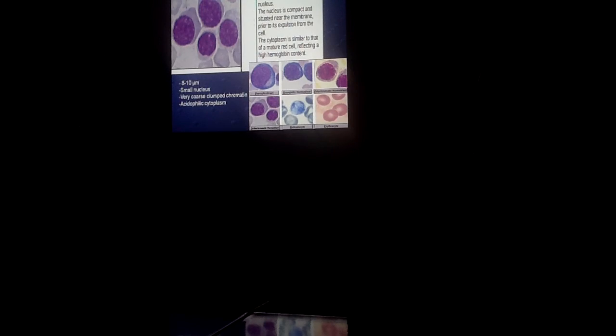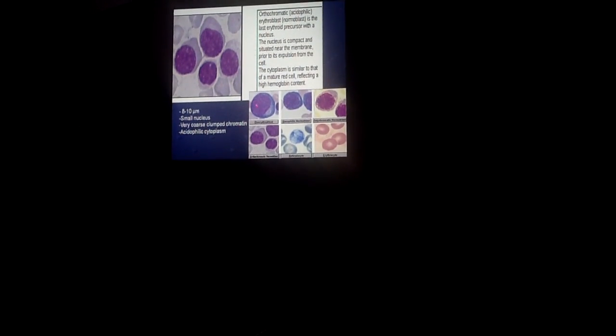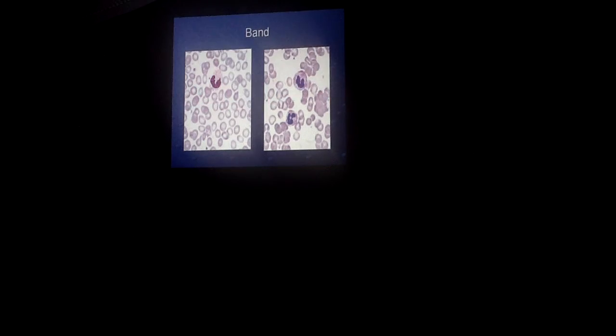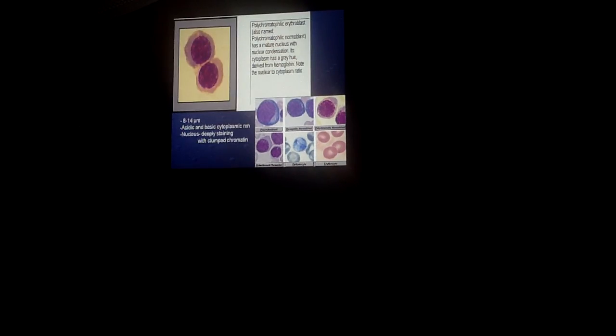Now, those are the cells which you should be able to identify for the bone marrow smear or bone marrow aspiration biopsy smear. Erythroid series, and then the myeloid series. Ito namang next group of cells, pwede na istadihan natin sila sa peripheral blood smear na lang.